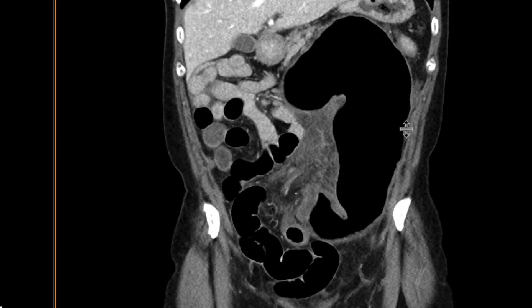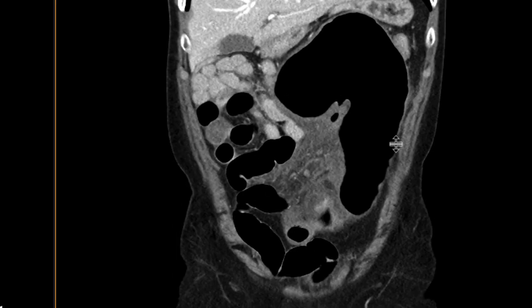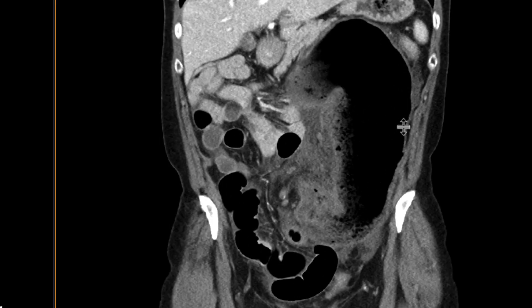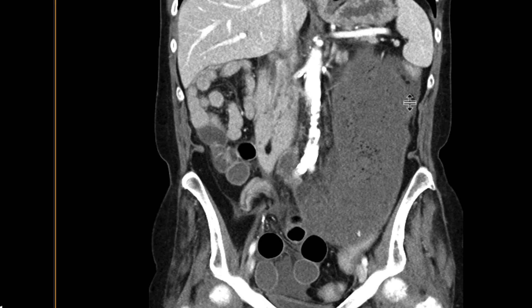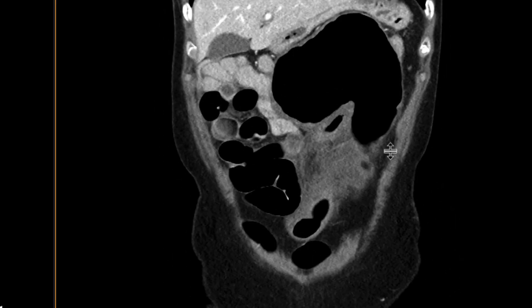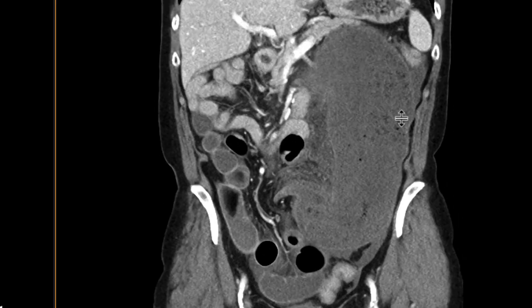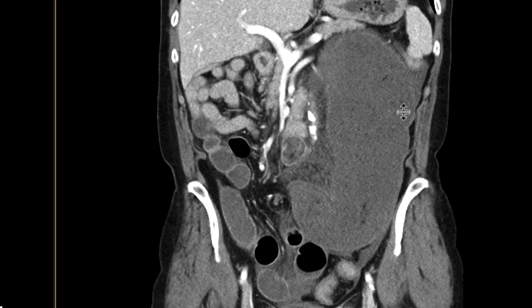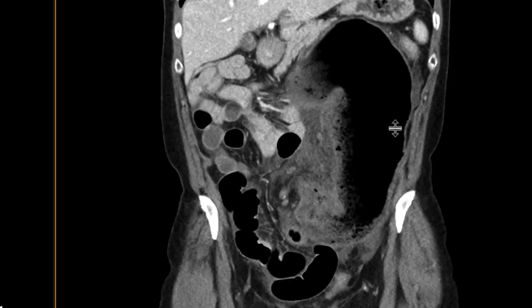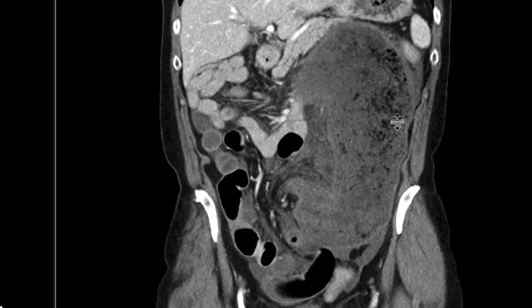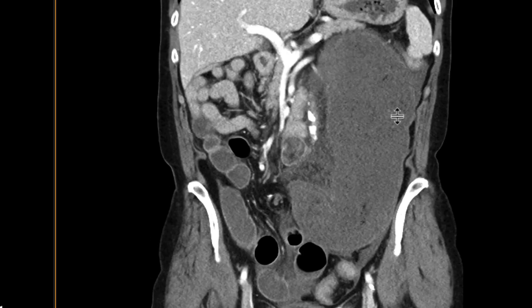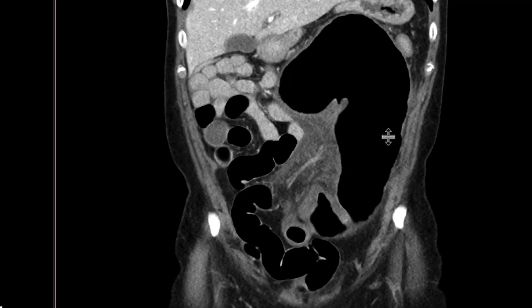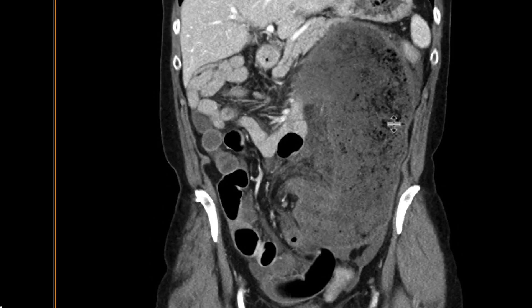This is a classic look for cecal volvulus. It typically happens in relatively younger patients with a longer mesentery, where the cecum can twist upon itself. It's a type of bowel obstruction involving the cecum. In this case, it became ischemic, and the patient went to the operating room and needed those segments resected.